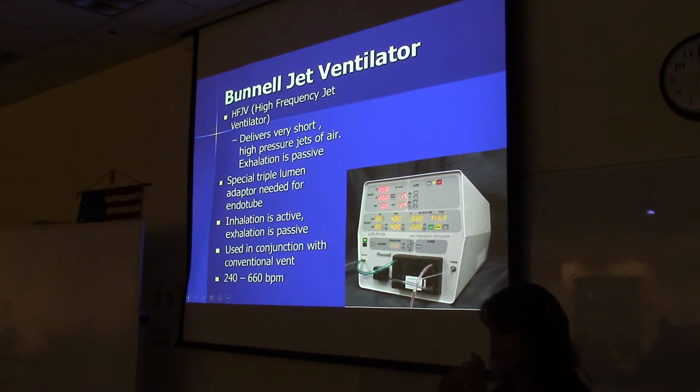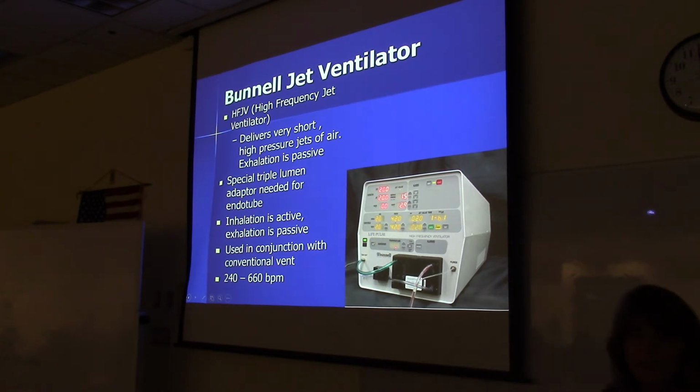It just allows you to add that. It's used in conjunction with a conventional ventilator.